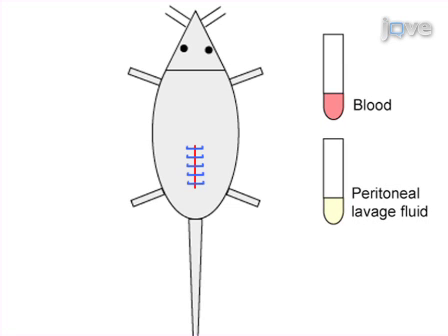Ultimately, results can be obtained that show increases in systemic and peritoneal cytokine levels, as well as symptoms such as lethargy and lethality.